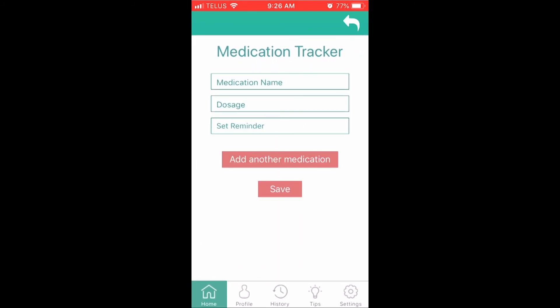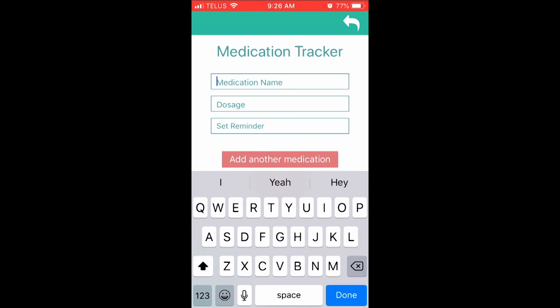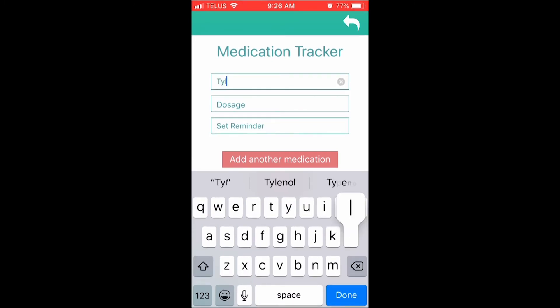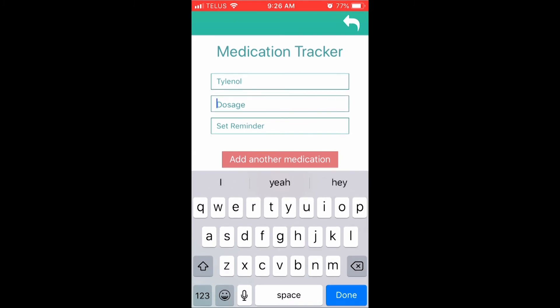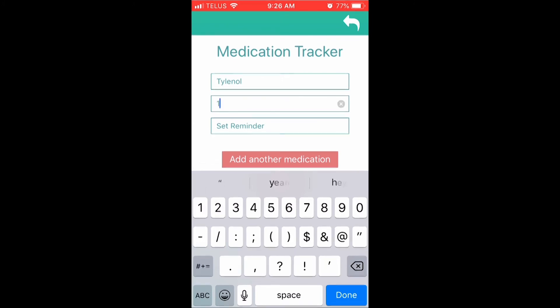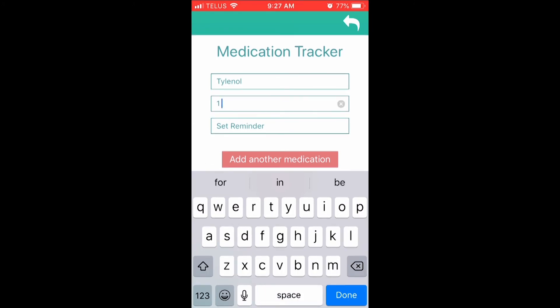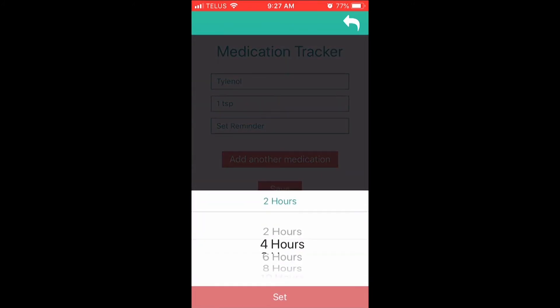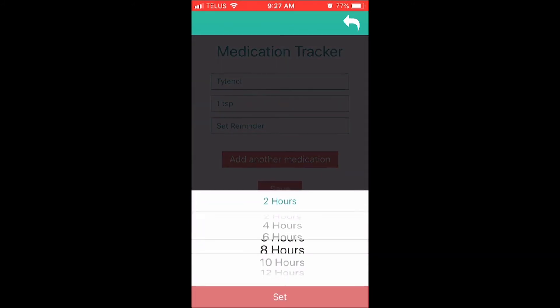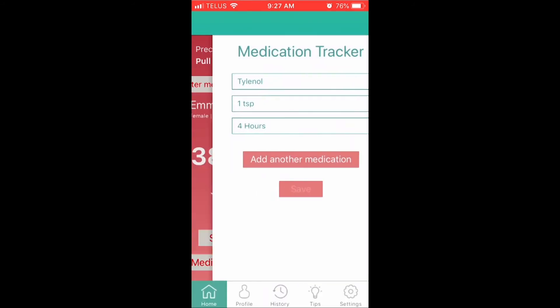To set your medication tracker, press the Medication Tracker button. Press the Add Another Medication button to list the medicine information. If you have multiple medications to administer, simply hit Add Another Medication and fill in the information. Once done, hit the Save button. If you do not want to save the information entered, simply hit the back button and no information will be saved.